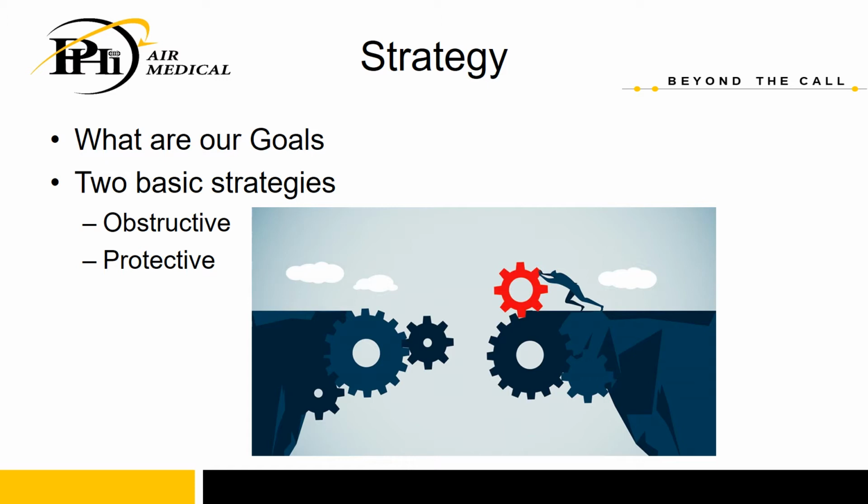Some people refer to it as the lung injury strategy, and this is where we're going to be using our higher PEEPs, higher respiratory rates, and lower volumes, in order to help protect that patient from any existing lung injury.